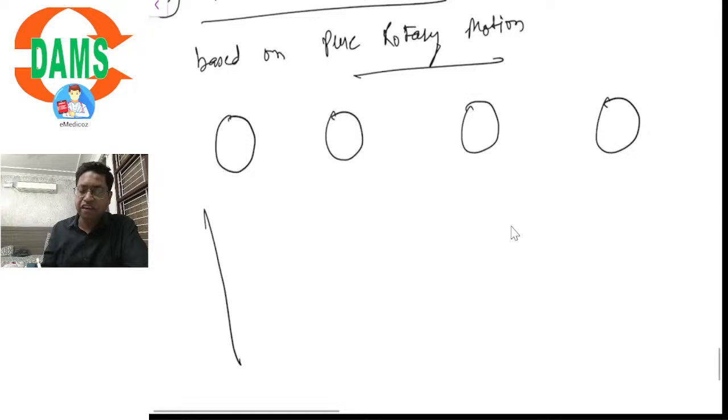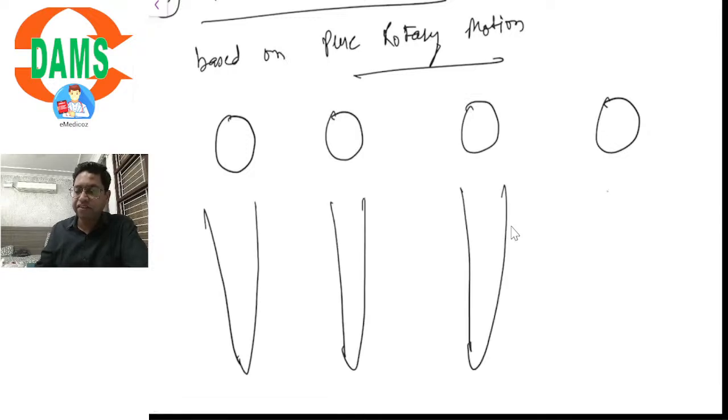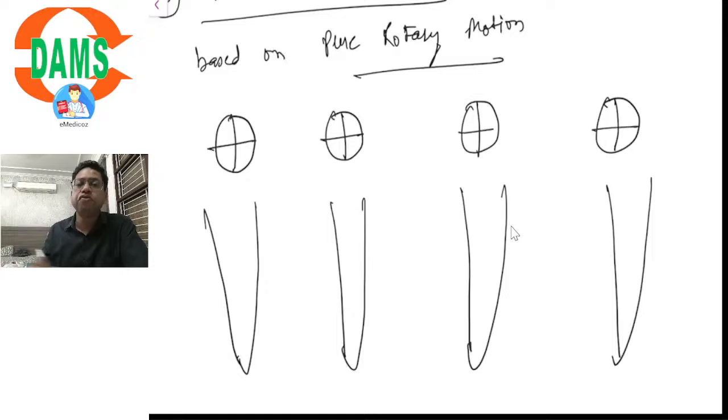And this is the root canal that is to be prepared with the balanced force technique. We imaginarily divide the cross section of the root canal as we see from above into 4 quadrants. Okay.